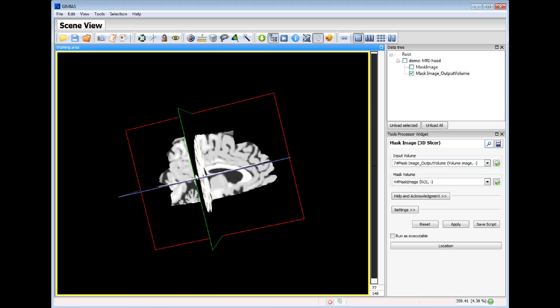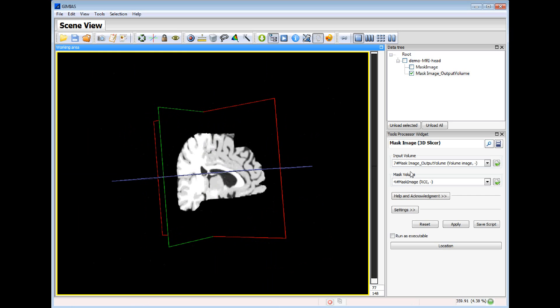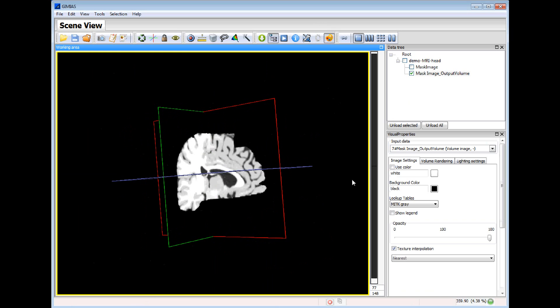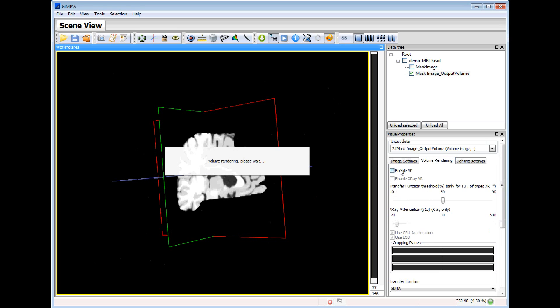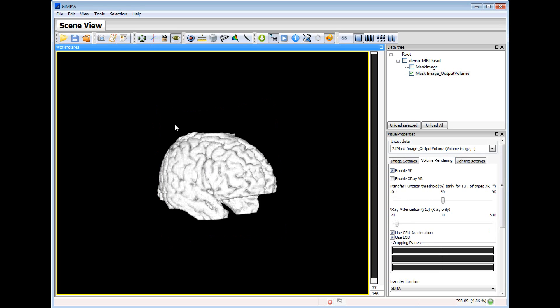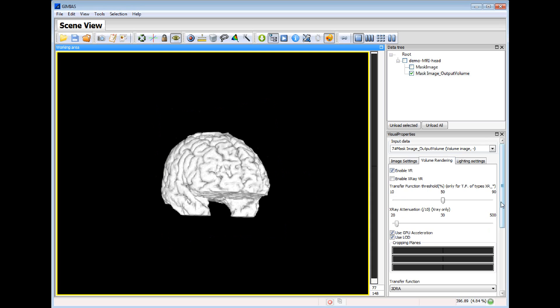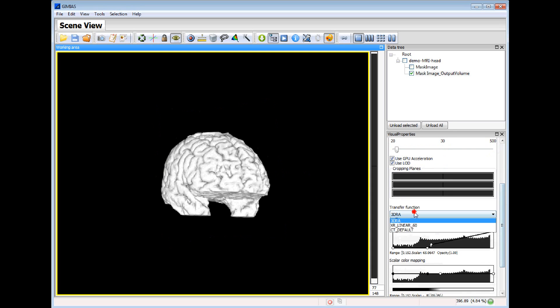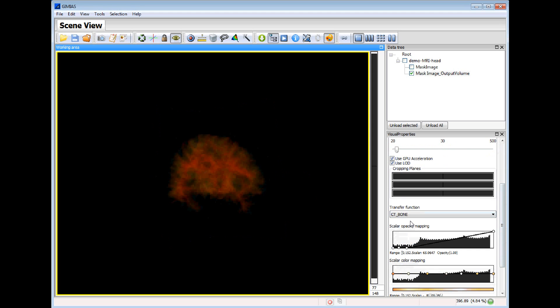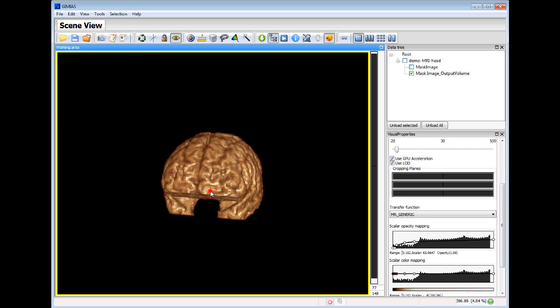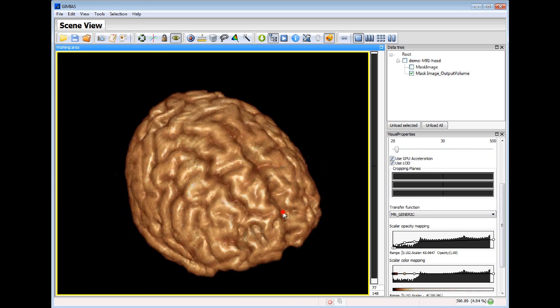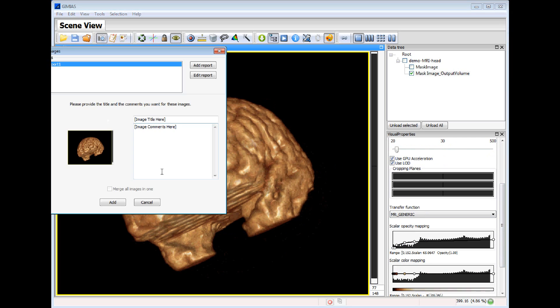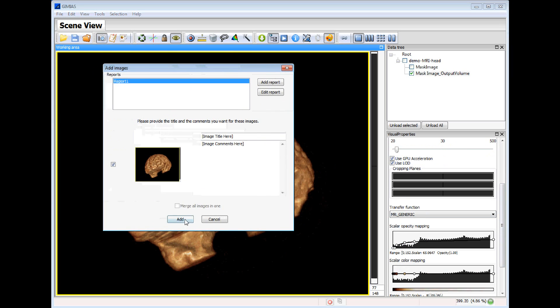And now we can add another snapshot of the volume rendering of the segmented part. We will hide the planes. This is the segmented part. We use another transfer function. And we can add this screenshot to the clinical report.